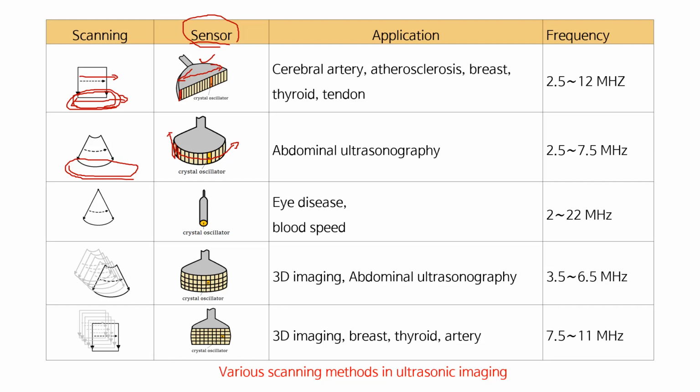This is just one transducer, so we check the region in this way.